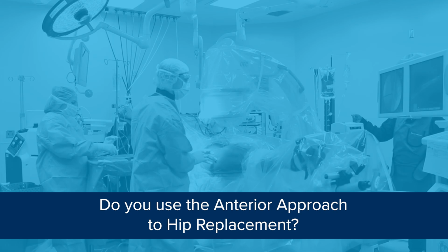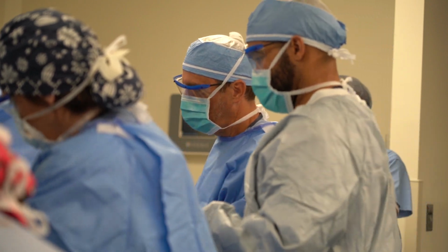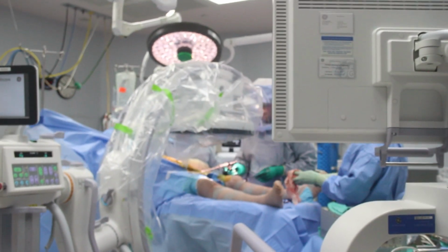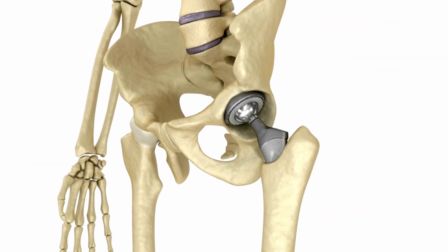I get a lot of questions about anterior hip replacement. I've had great success since 2008 using that technique. I think the biggest thing people need to understand, it's still a hip replacement, but it's done through a different approach or in a slightly different way. When I'm doing the hip replacement, I can actually see on the x-ray while I'm doing the surgery what's happening. I can check the x-ray, I can check the leg lengths, I can check the positioning of all the components, and it's all real time, so if I need to change something, I can change it right then and there. So that's a big difference.